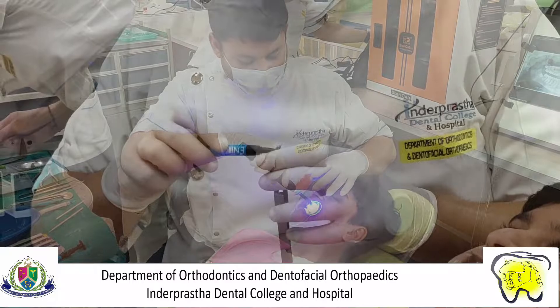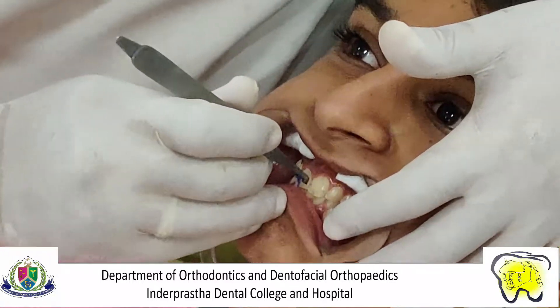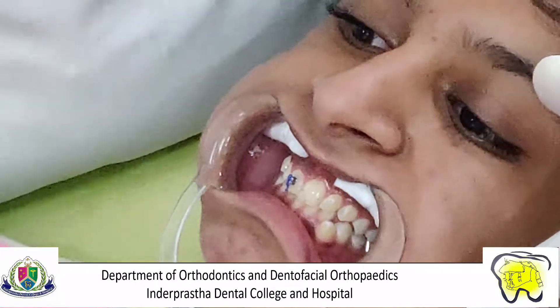An adequate amount of composite is applied on the bracket and placed on the previously designated location over the tooth, marking the completion of bracket placement.